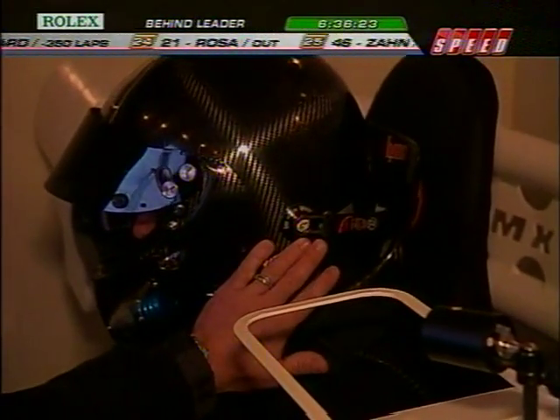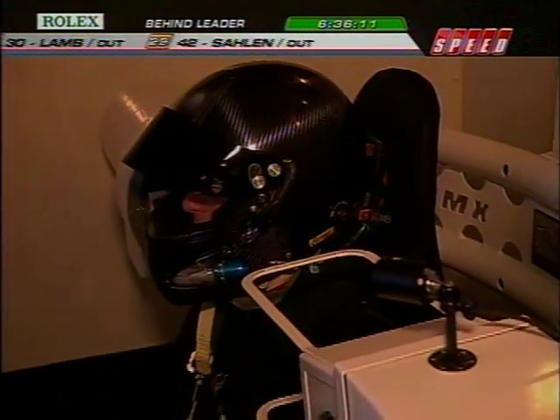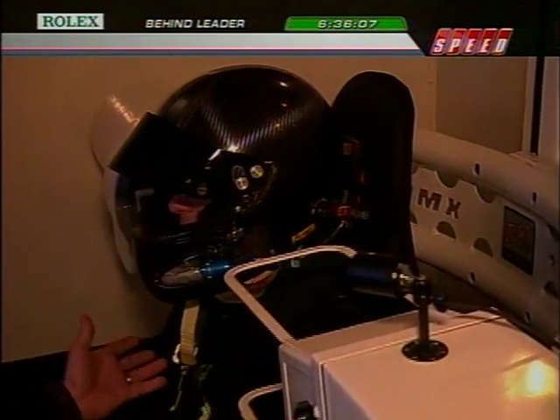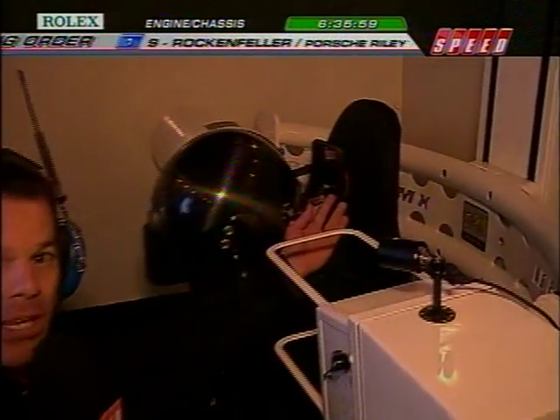These tethers come in 17 to 19-inch lengths, and what a typical driver wants is the longest length possible so they can turn their head, but that really negates what the Hans device is for. It's supposed to be there for stability in the neck in a forward accident. So they're looking at Darren's neck, all the bones in his neck, and as Darren throws his head forward, you can see these tethers get taut.